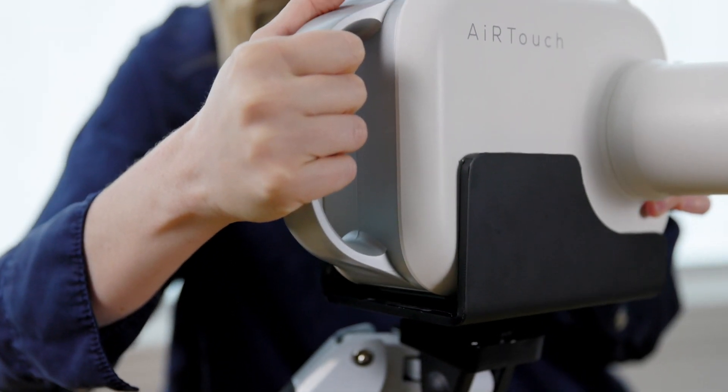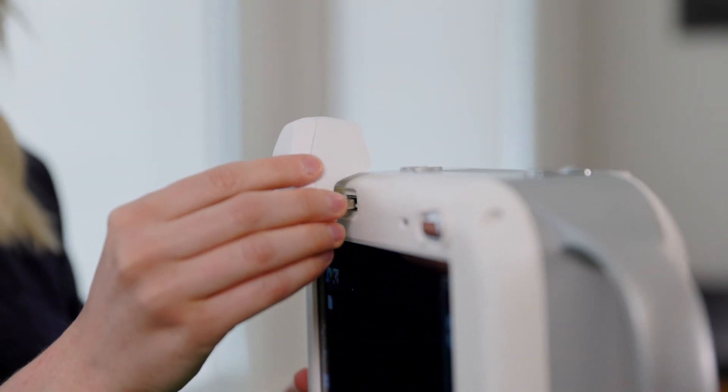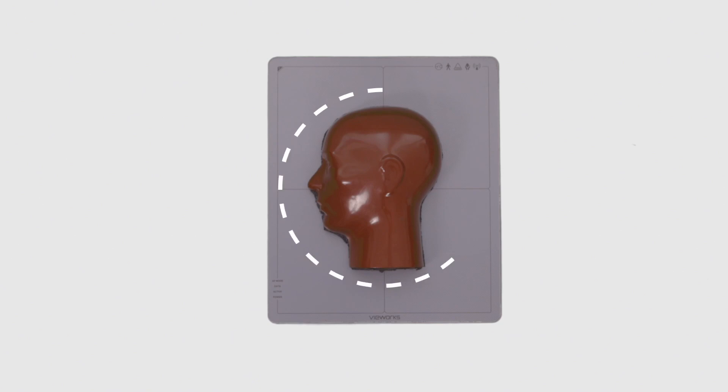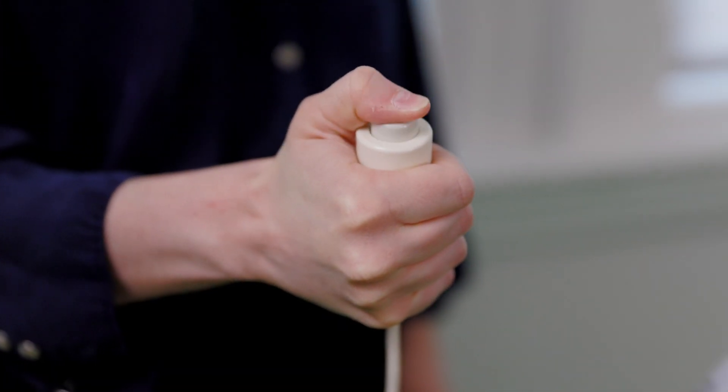Please refer to our user manual for a complete list of x-ray techniques. Next, ensure the laser light is positioned in the center of the anatomy. Depending on the SID of your technique, we have a lookup table to show the size of the active area. Now you're ready to acquire your x-ray — press the two-position hand switch. You'll hear an audible indicator to let you know that the x-ray was taken.